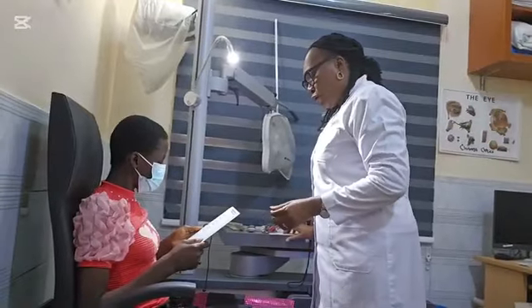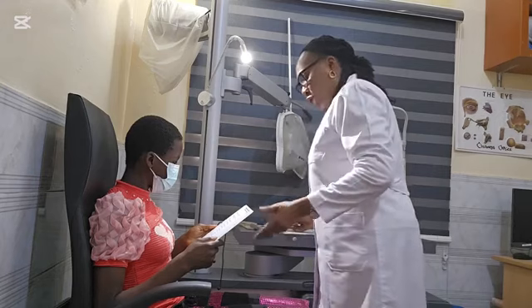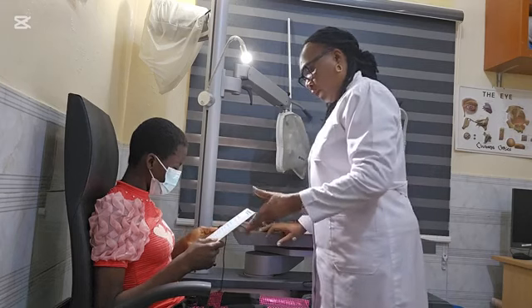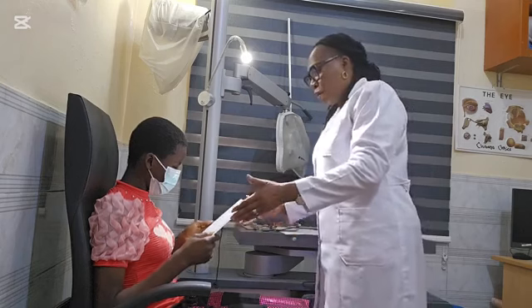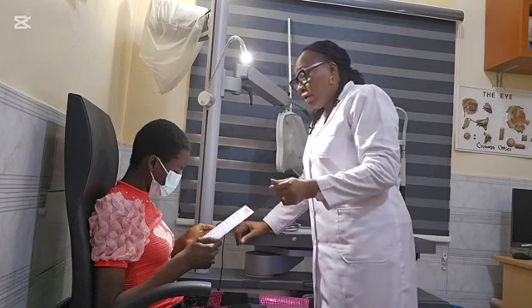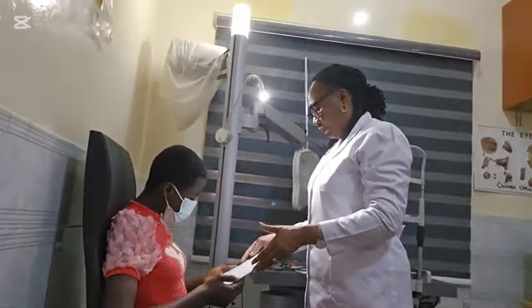So now we are going to try the magnification at near. Her actual VA, she read 1.6 M, and she desires to read 1.0 M. And for her to read 1.0 M fluently, she needs a reserve acuity. So we'll do the magnification at near.